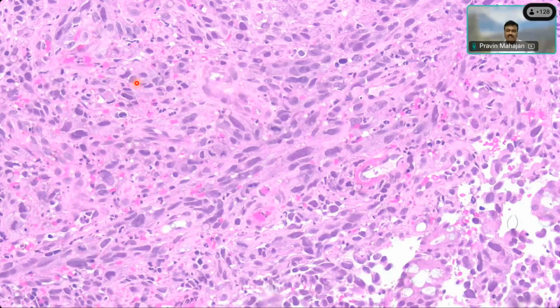Okay, now describe on this high power, Arpita. You were trying to describe something to me. What do you see here? We can see a good amount of nuclear atypia, hyperchromatic nuclei, and the NC ratio is disturbed, sir.